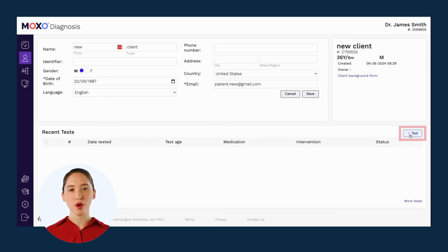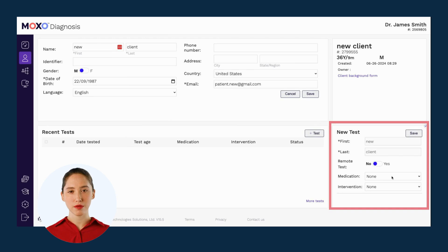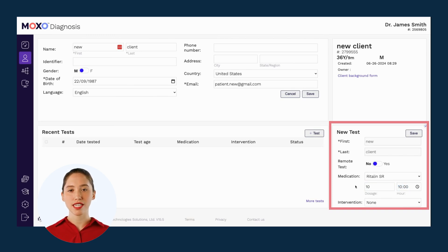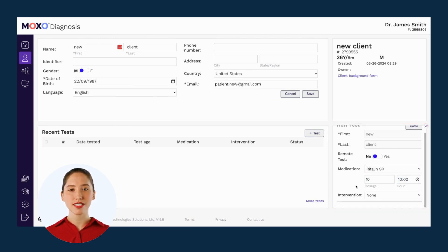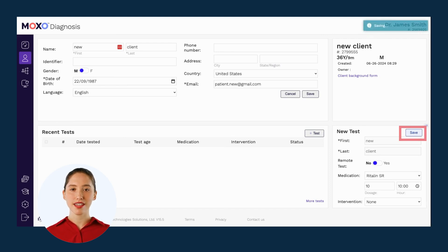When you click on that button, a window will open up on the bottom where you can confirm the client's information, choose if this will be a remote test or an in-clinic test, and indicate if the client will be under the influence of any medication or intervention during the test. Finally, make sure to click save. This is true for both new and existing clients.